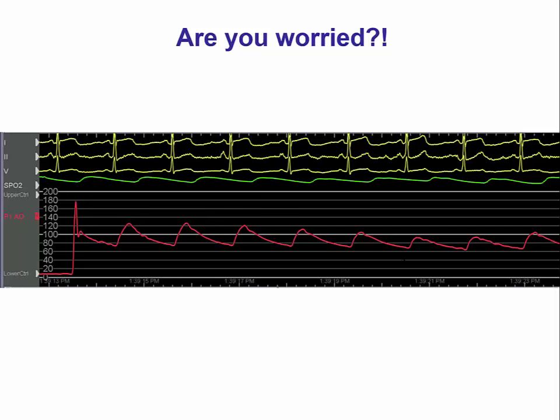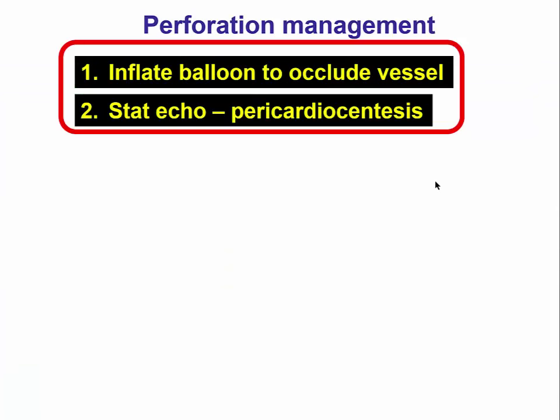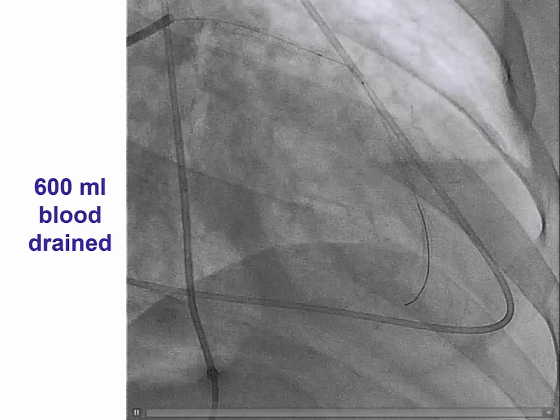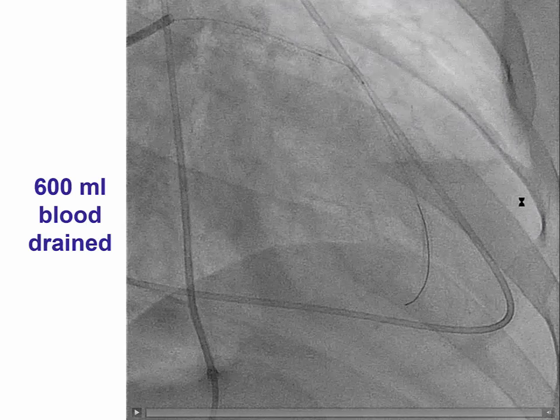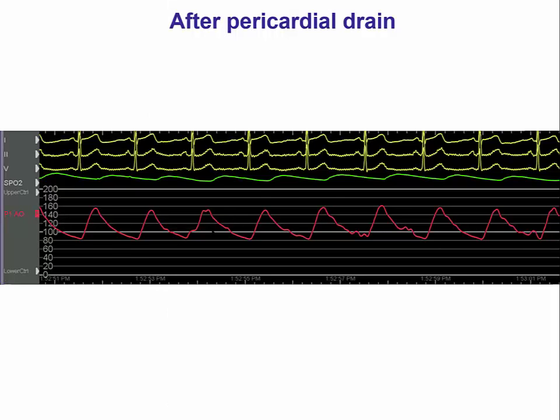The patient's blood pressure began getting a little low, and six minutes later there was significant hypotension, strongly suggesting tamponade. In this case, you perform a stat pericardiocentesis. It is helpful if you have echo available, but if not, pericardiocentesis can be performed under x-ray guidance. That is exactly what we did here. The pigtail was inserted into the pericardium and 600 mLs of blood were drained, after which blood pressure significantly increased and the patient became hemodynamically stable.